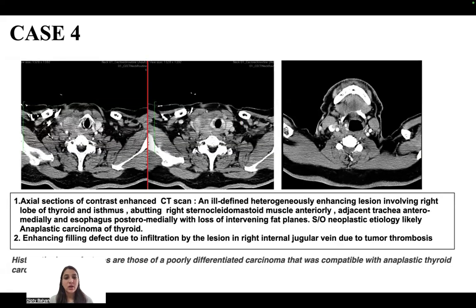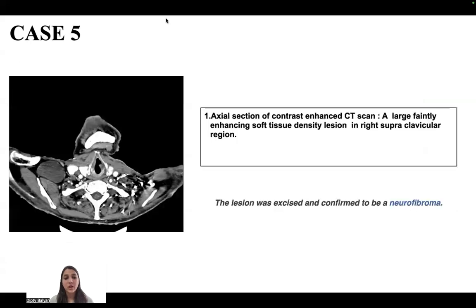On axial contrast enhanced images, an ill-defined heterogeneously enhancing lesion involves the right lobe of thyroid and isthmus, abutting the right sternocleidomastoid muscle anteriorly and adjacent trachea anteromedially and esophagus posteromedially with loss of the intervening fat plane, suggestive of neoplastic etiology, likely anaplastic carcinoma of the thyroid. An enhancing filling defect due to infiltration of the lesion in the right internal jugular vein indicates tumour thrombosis. Histopathology shows poorly differentiated carcinoma compatible with anaplastic thyroid carcinoma.